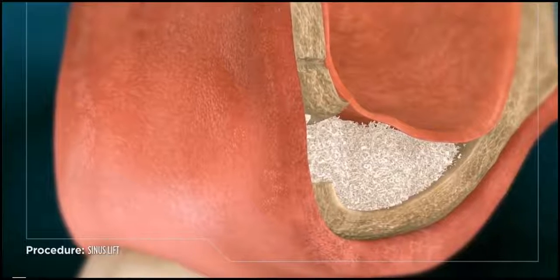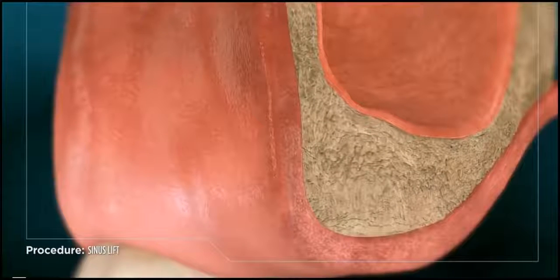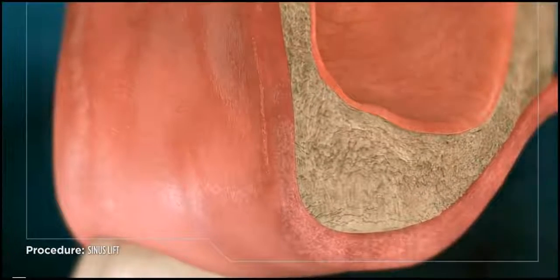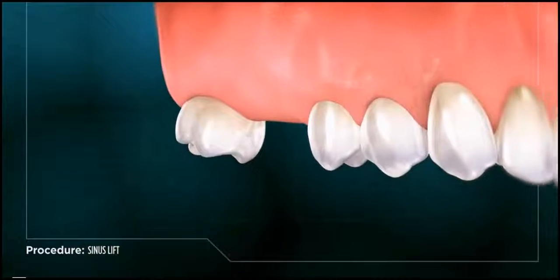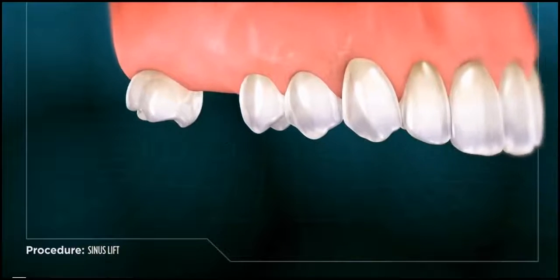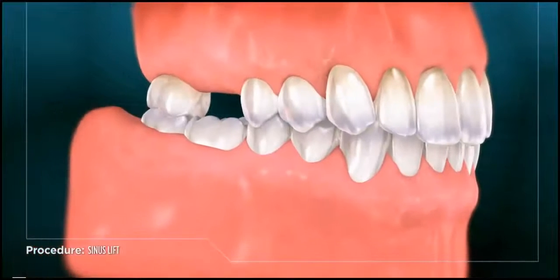During this time, the synthetic material solidifies beneath the sinus and permanently blends into your natural bone tissue. Once the site has fully healed, the bone will have regained its original strength and stability and further procedures such as a dental implant can be initiated.